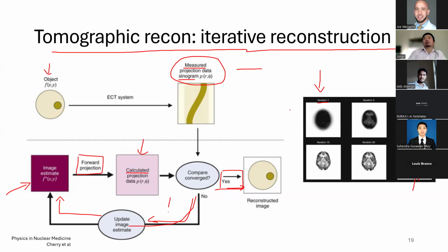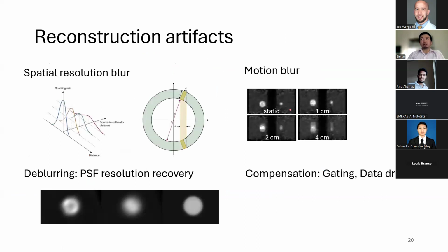And why do we need to create an objective function? Once I reconstruct the images, we get the proper image, right? The answer is not really, the reconstruction is full of artifacts. So in an ideal world, when you reconstruct the images, you recover the object. But in this case, we never truly recover the images. So these are just some reconstruction artifacts that I'm showing.